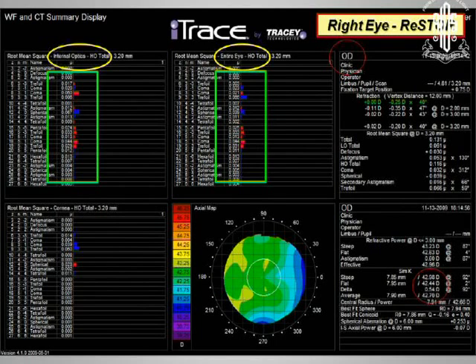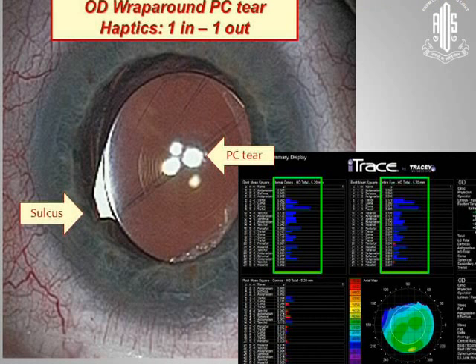Again, a normal quality of the cornea. So this is this patient now, and so the question is, what would you do? So now I've shown you that his complaint is real. His optical quality is poor. He's got poor optics. So how many people now would exchange this lens?